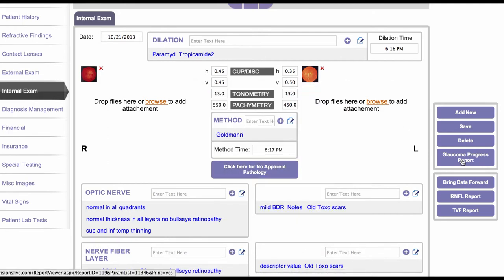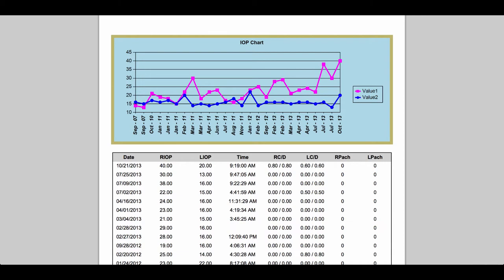Another interesting feature of this particular tab is the glaucoma progress visit report. With this report you'll be able to see a synopsized history of this patient's glaucoma values that have been recorded over time. You can see here we start with September 2007, with the right and left IOP, and you can see this graph where they've gone up and down over the years, with the right eye being a little bit higher at the most recent visit.